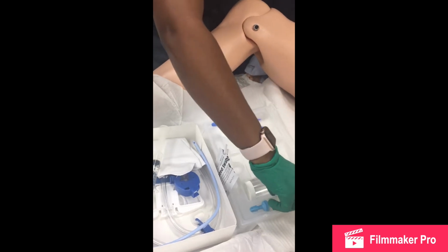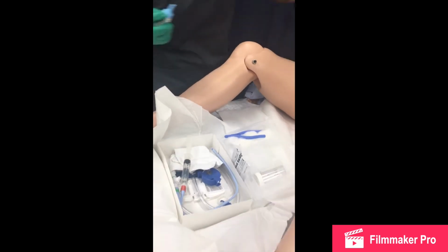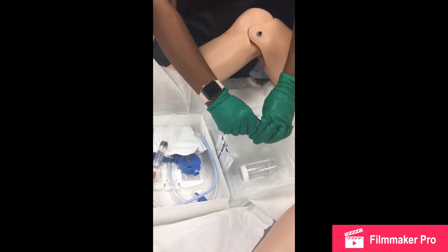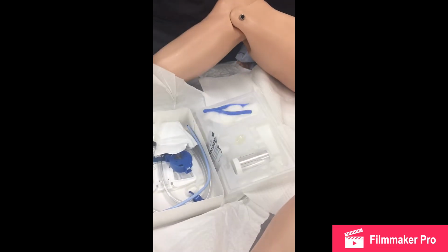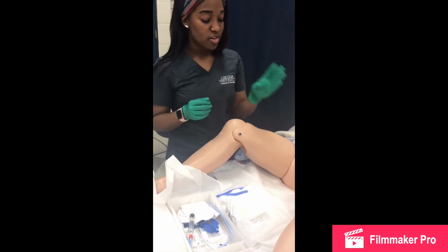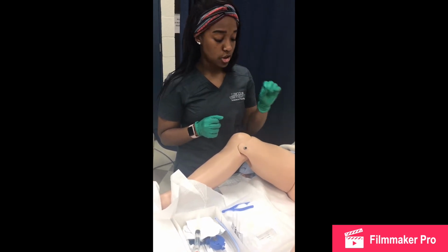Next, I'm going to take my lubricant, place it anywhere on this clear area. So now that I have my lubricant set up, I'm going to be able to start cleaning my patient. I know that when I start cleaning my patient, my non-dominant hand is not going to be sterile anymore, so I cannot use it for the procedure.